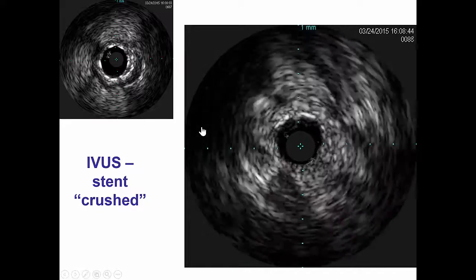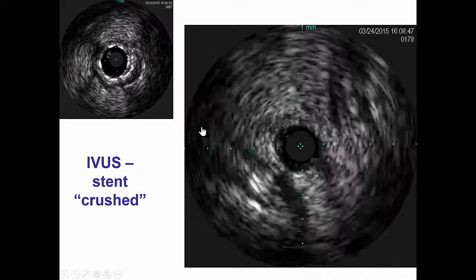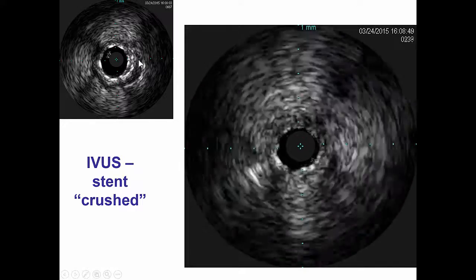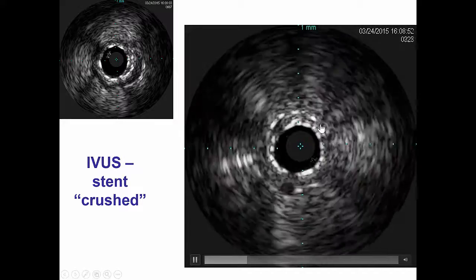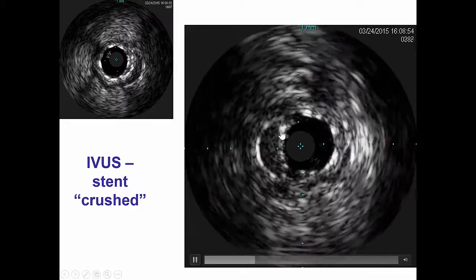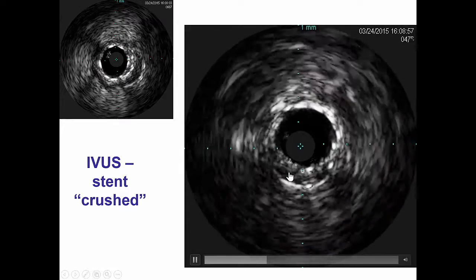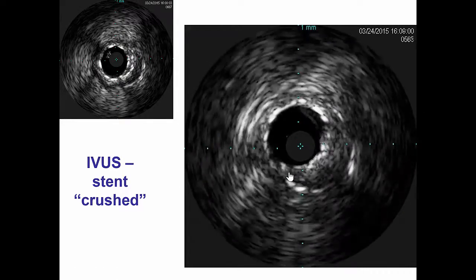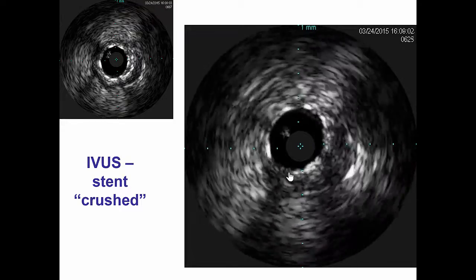Intravascular ultrasound after the stent was crushed demonstrates the double layer of stent. This is the new stent and this is the previous stent that is crushed on the outside of the vessel. However, there was good stent expansion and stent apposition of the newer stent.